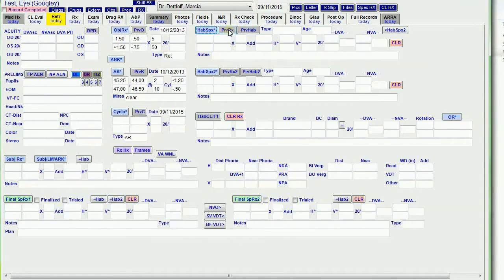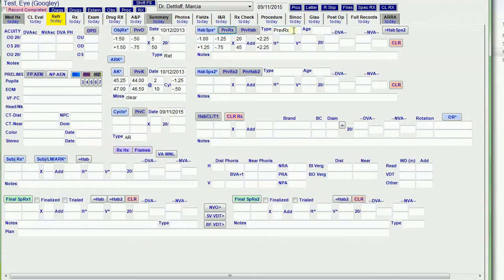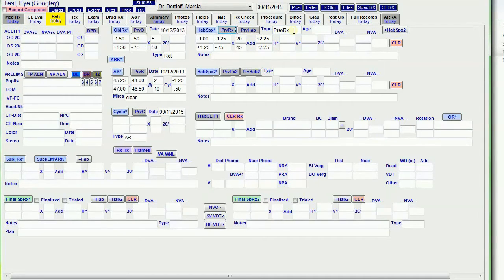This pulls over their previous RX, and I use that if they don't have their glasses with them, or sometimes I just pull it over because I want to see what the last prescription is. It's easier to see it here than it is looking at the other older tabs.